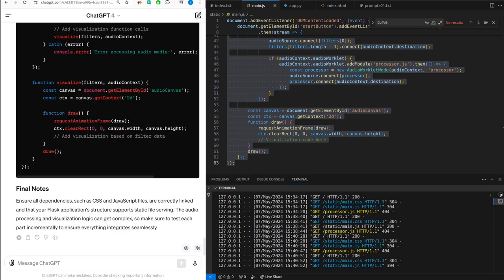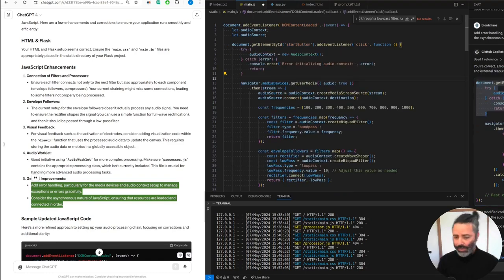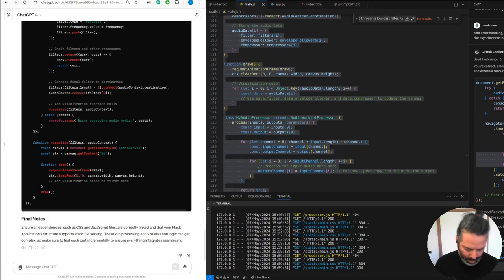3. Visual feedback. For visual feedback, such as the activation of electrodes, consider adding visualization code within the draw function that uses the processed audio data to update the canvas. This requires storing the audio data or metrics in a globally accessible object. We only added that button because we need an interaction with the application for the sound to work. It's probably that GPT-4 doesn't need the help from Copilot.